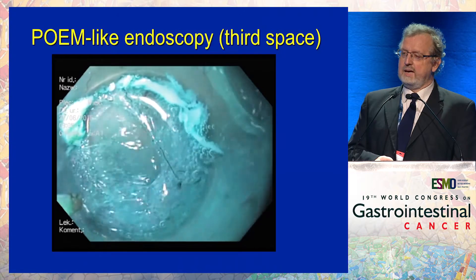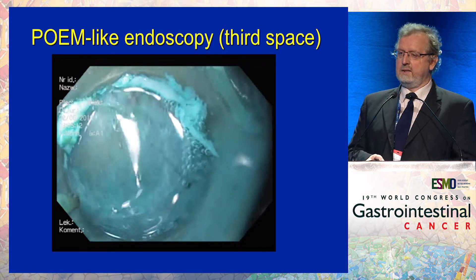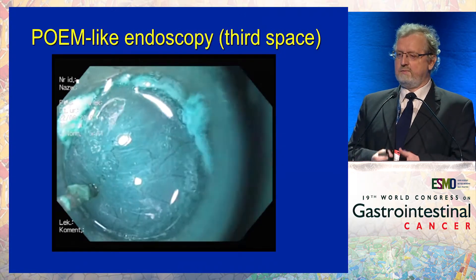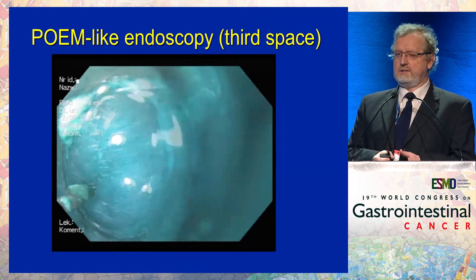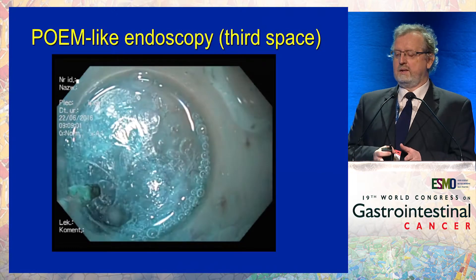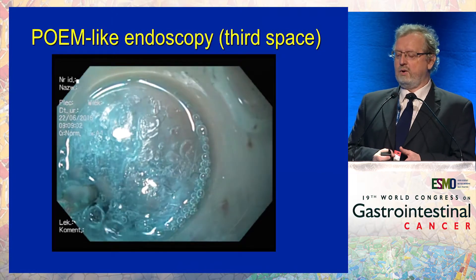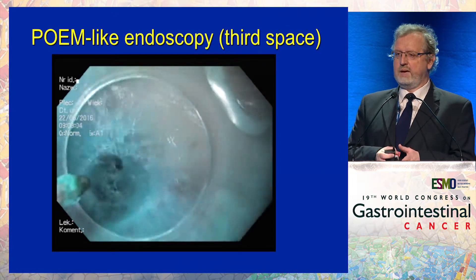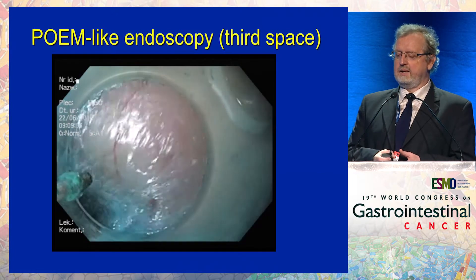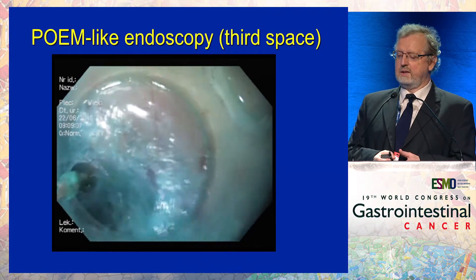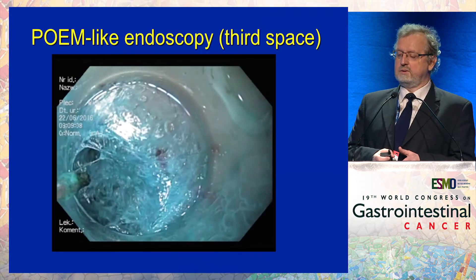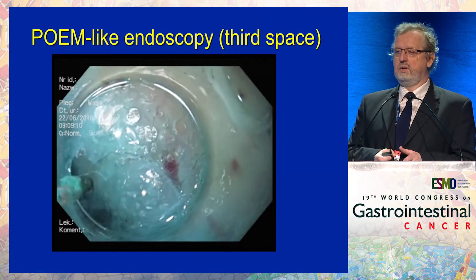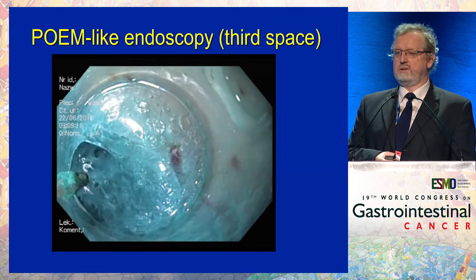We go down and make a tunnel within the esophageal wall, allowing the whole endoscope to enter inside. We go down — this is the muscle layer — continuing down to the lower esophageal sphincter.